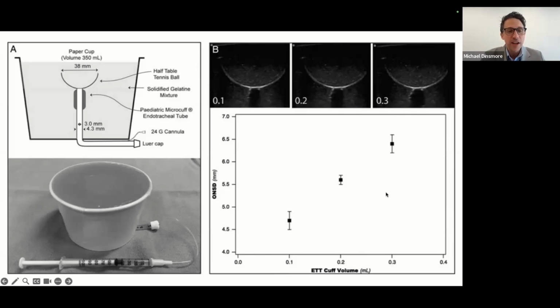Okay, so this was great. We got some good feedback for this, but a lot of people said this needs to be a little bit more realistic, because the scanning actually is hard when you have the orbit in there and the eye and the angulation. It's not just a flat surface. And then the other thing is they really were having difficulty with the force.